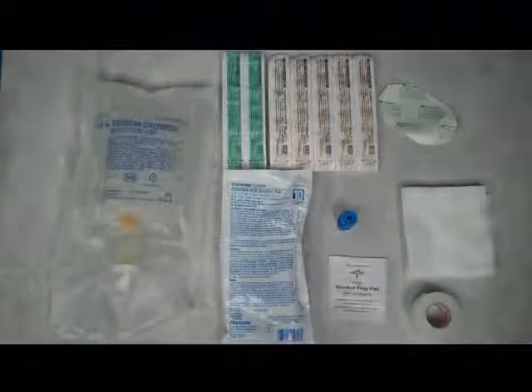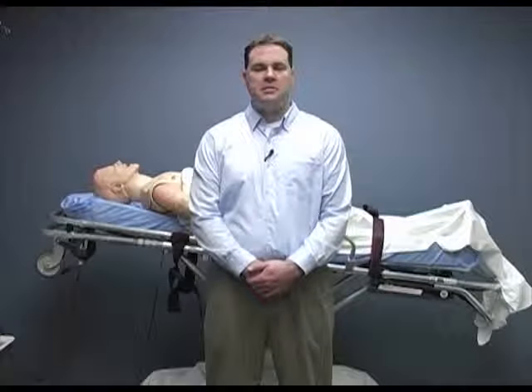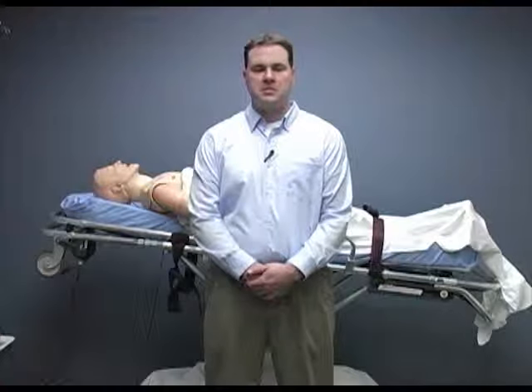As you can see we have a bag of fluid, IV catheters of varying sizes, an IV administration set, an alcohol prep, a roll of tape, 4x4 dressings, a selection of site dressings, and a tourniquet. The equipment you use may look different than what I have here. I recommend you take a moment to familiarize yourself with the equipment your service uses.